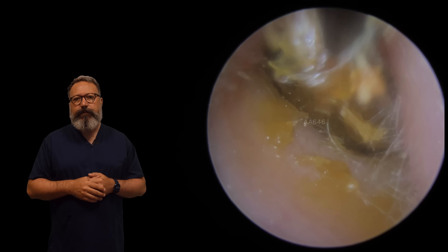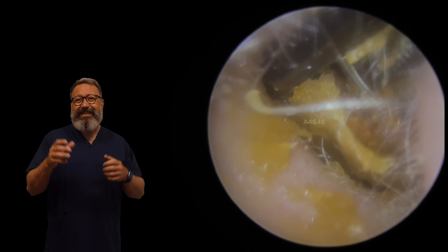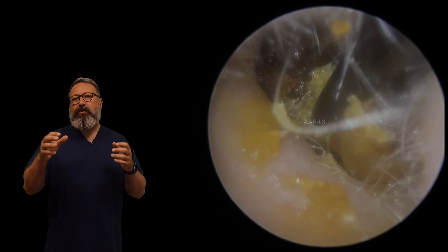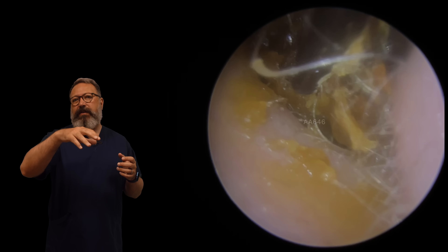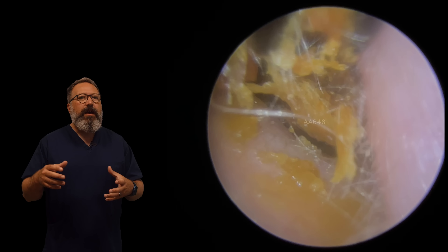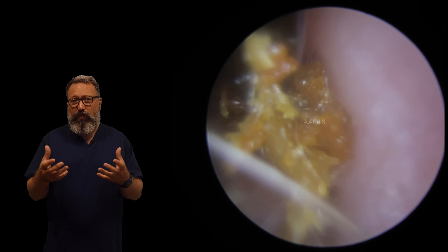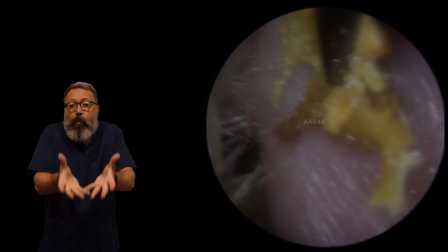Now what we have here, which we're just pulling away now with the crocodile forceps, is a really tough old piece of wax, but it's also got a lot of skin just underneath. Now that's why I'm using the forceps. I know it looks like they're not being particularly effective at the moment, but in some ways they are. They're getting rid of that little bit of skin because what we're trying to do is draw this plug over that piece of skin.